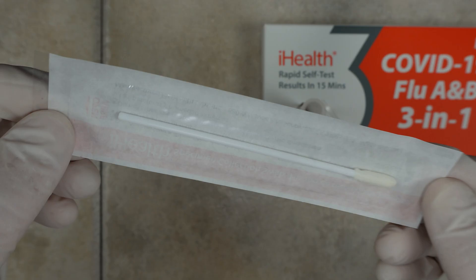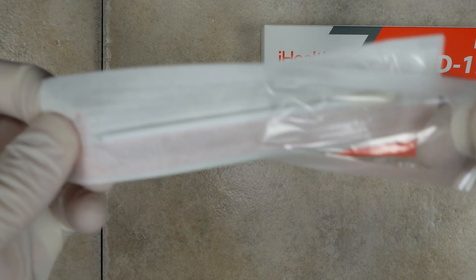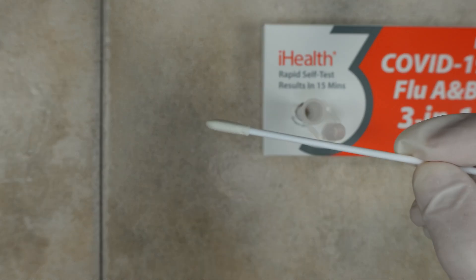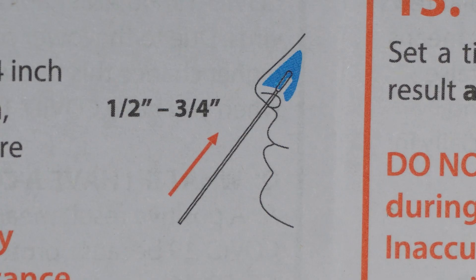Open up one of the cotton swabs without touching the cotton end of it. You are going to be swabbing the inside of both nostrils with this one swab. While it's inserted in your nose, you need to go around five times in each nostril. You need to go inside about one half to three fourths of an inch if the person being tested is an adult.